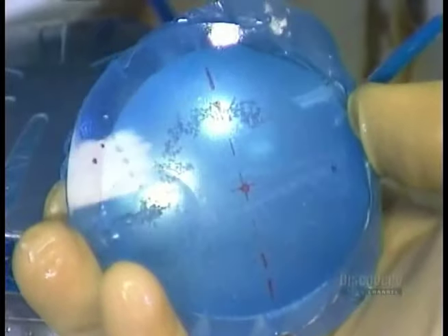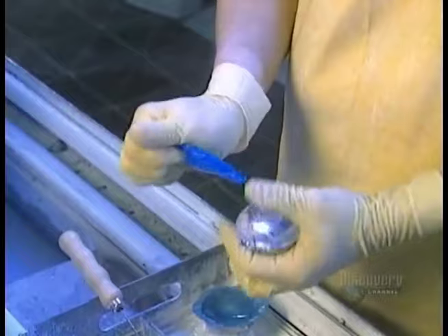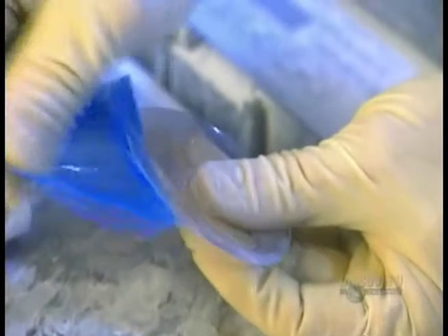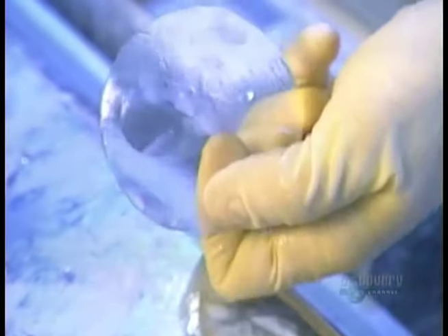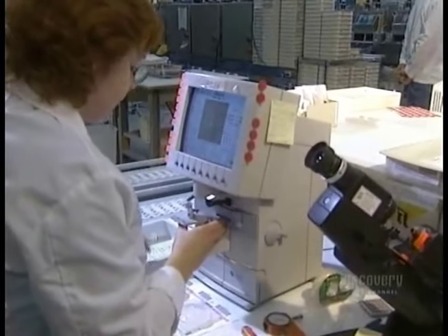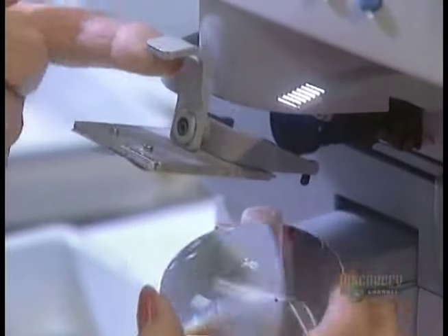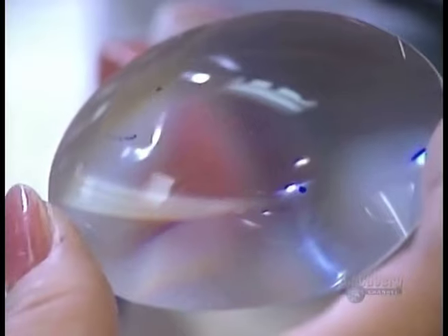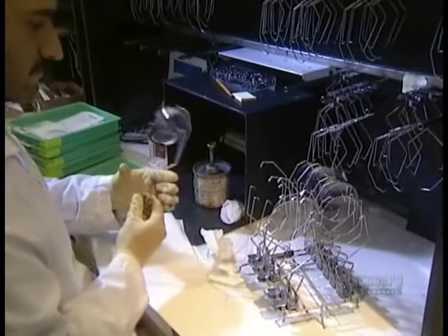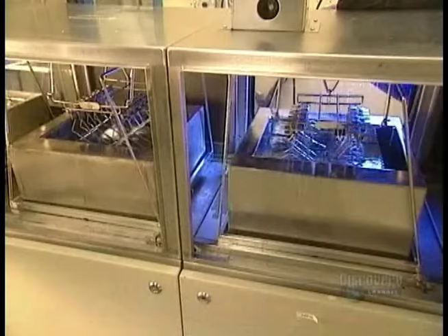Now that the lens is perfectly shaped, they remove the metal attachments, then peel off the protective film on the other side. Using a machine called a lensometer, they make sure the prescription is accurate. Next, the lenses go through an automated 15-stage chemical cleaning, then are coated with varnish to make them scratch resistant. They go into an oven for three hours until the varnish cures.